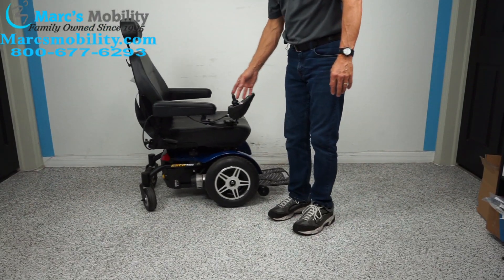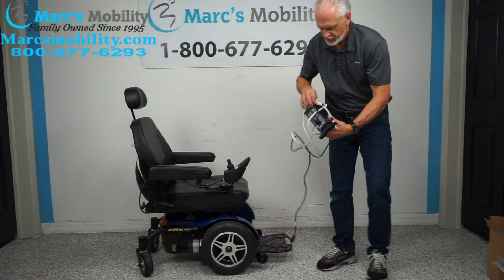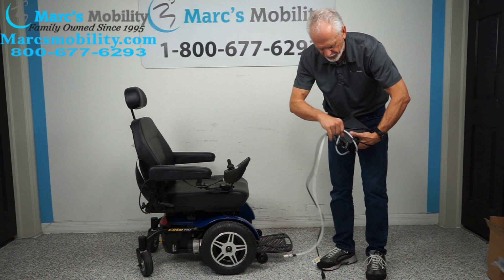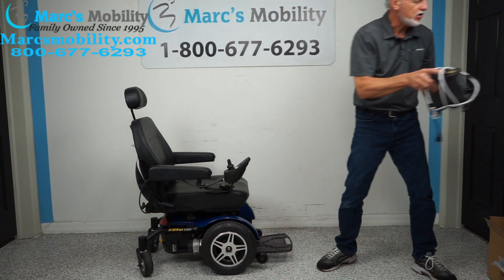When you charge the batteries on this chair, take your charger and plug it right here. As soon as the light turns green on your charger, the batteries are full. This charger will recognize when the batteries are full and automatically stop charging.